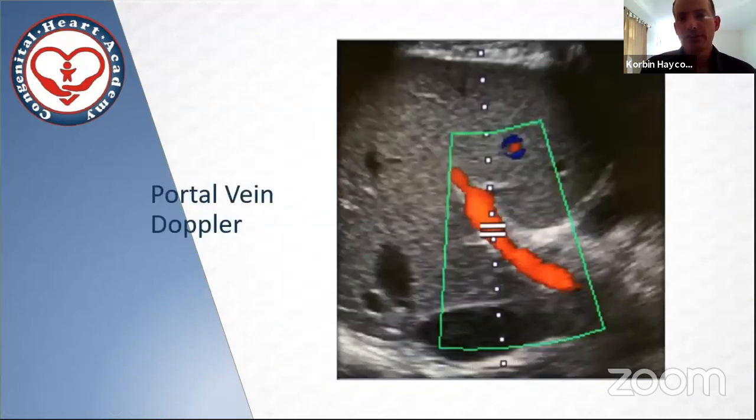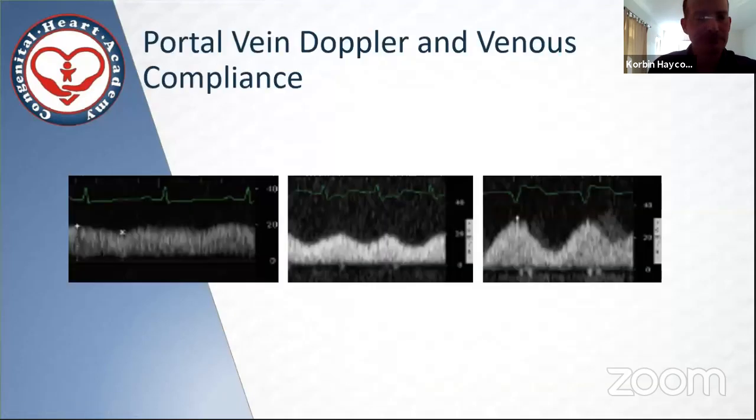The portal vein of all these is the easiest to Doppler, and basically just go from an anterior axillary view. The portal vein will divide right after the porta hepatis into right and left branches, and the right branch usually comes directly at your Doppler gate. So it's a very good, easy vessel to evaluate. So this will behave like a small vein normally, with just kind of undulating, phasic, nice, easy, rolling, gentle flow.